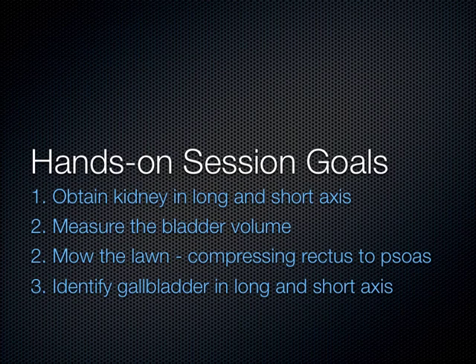It does something too with the lateral abdominal wall muscles maybe too, brings those in a little bit tighter so you can use them for compressibility. Brings the contents of the abdominal cavity, the intestines, a little bit more anterior, so you're compressing anteriorly and not laterally coming from the side. That's the only thing I can think of. I get that question all the time, and that's how I think of it. It just brings everything together a little tighter into the abdominal compartment.